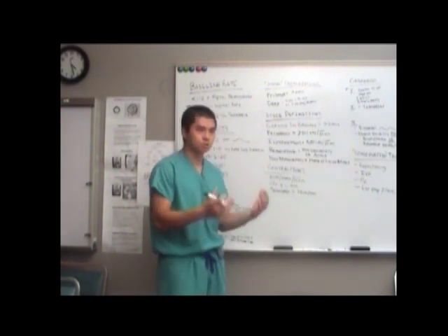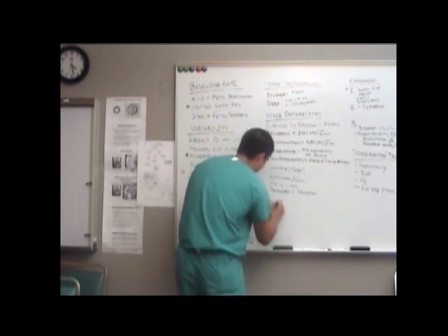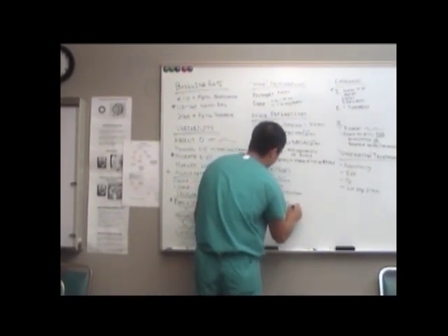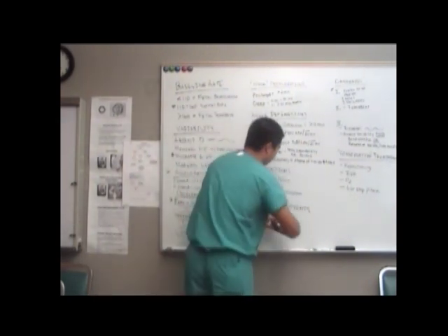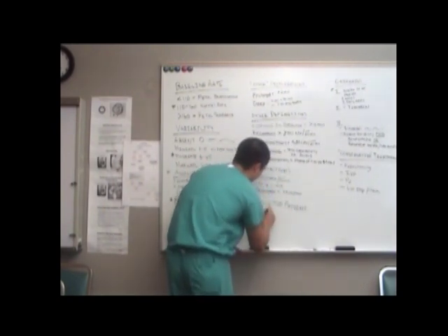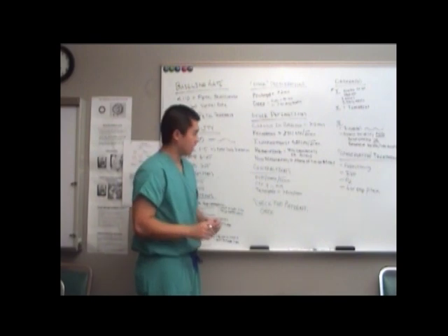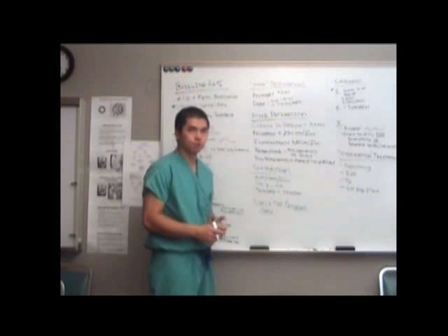So the first thing you always do is you check the patient. I can't emphasize that enough. It seems really simple, but it takes at least a couple months to finally hammer it home in your mind to remember to do that. So what happens if you just checked the patient 5 minutes ago, you go out of the room and then there's a couple of deep variable decels, and you go back to the room? You just checked the patient 5 minutes ago, what should you do?